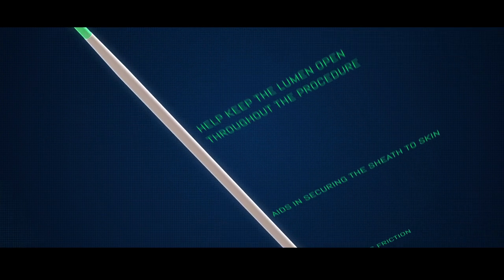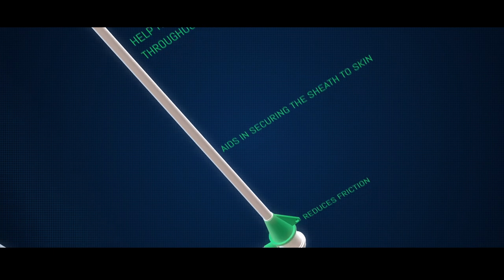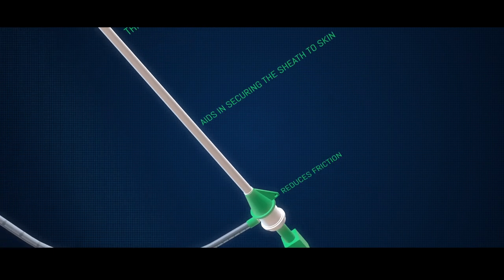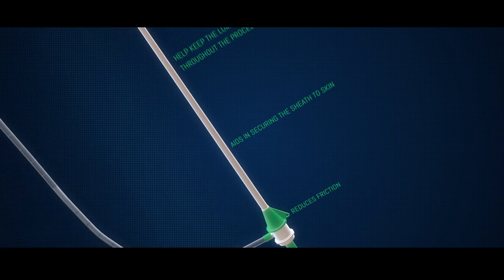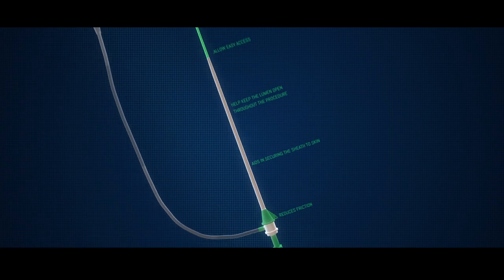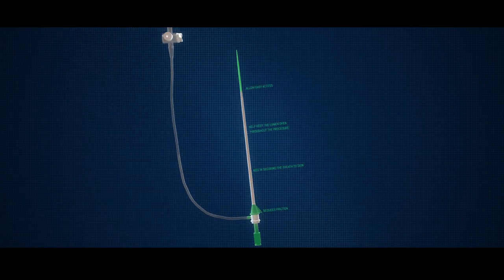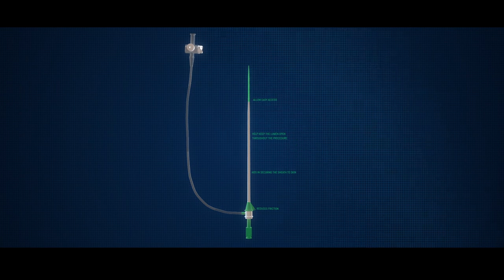All these features make Transintro a better product as compared to other similar devices available in the market.